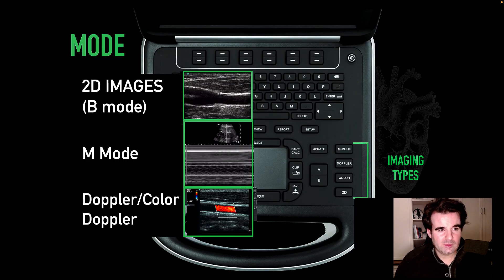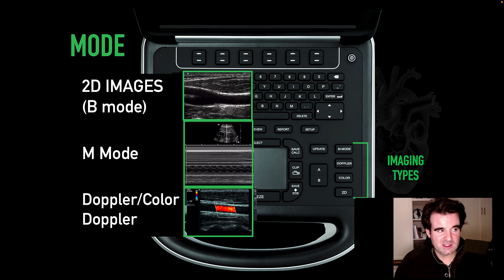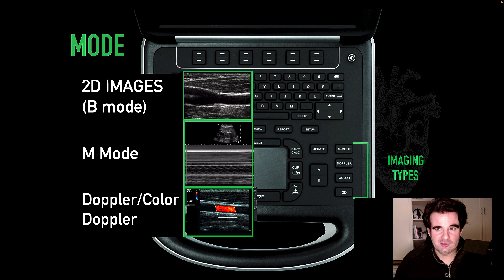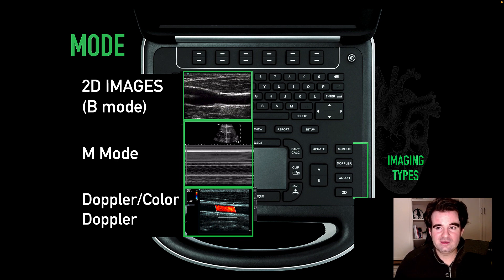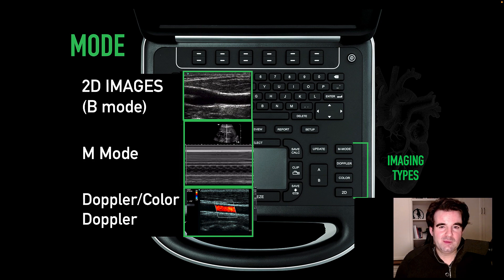When we talk about Color Doppler, it merits mentioning that it is often used to supplement 2D or brightness mode imaging, to really allow us to see rapidly moving elements, especially those that are not processed by 2D or B-mode imaging.